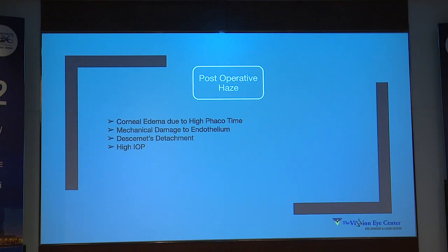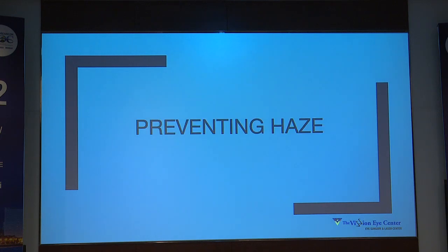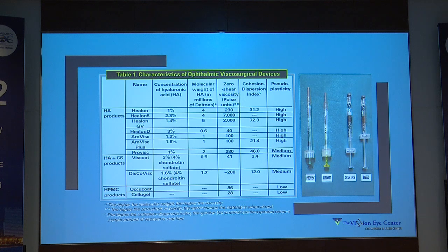That's why surgeons are always on their toes at every given point of time. So we'll discuss each one of them. Preventing the haze is a very important criterion. You have excellent viscoelastics available, dispersive and cohesive. Use them at your discretion. Now you have the Indian versions also. Fairly good, relatively very cheap, don't economize.